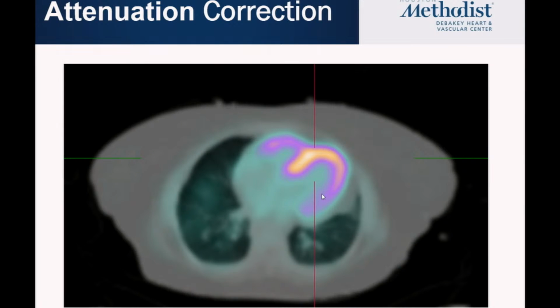Now, with CT, we can fuse the images, and now you have the low dose CT and the PET information, where you put both of them in fusion imaging, or hybrid imaging, and now you get the attenuation. You can see where that attenuation corrected image is coming from.